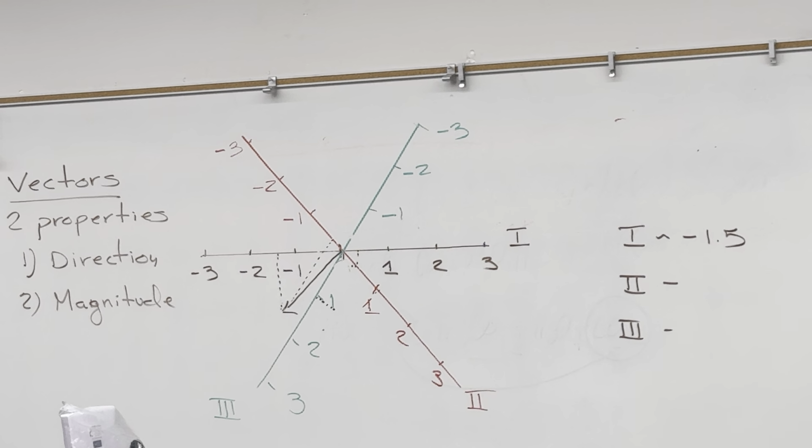Here's our EKG. And this vector may represent that point right there in the trace. So these vectors are instantaneous. And all we're doing is looking at one specific little snapshot over the course of an EKG. You guys with me on that? So that vector up there represents an instantaneous moment. It's not the entire graph. It's an instantaneous moment within that graph.